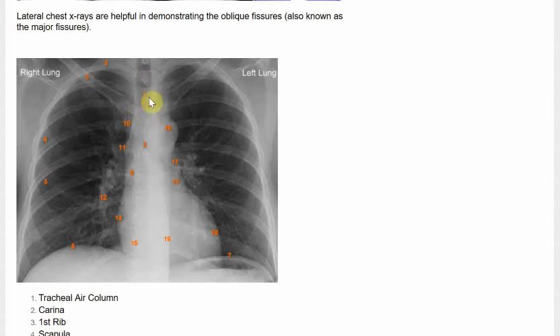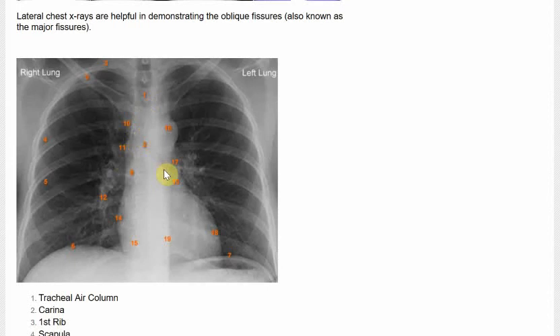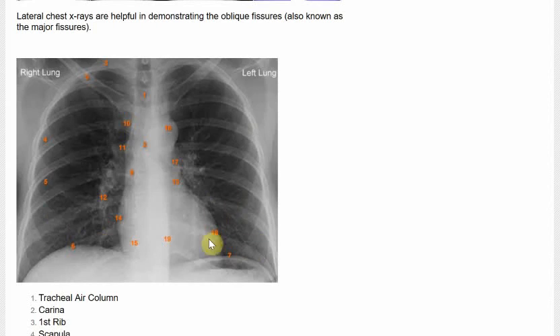Then A for airways — this is my system now. A for airways, making sure the airway is central and there's no pneumothorax where the trachea would be deviated. B is for bone and breast — making sure there's no bony metastases, because I have diagnosed a problem with cancer in someone with breast calcification. The breast sits there as you all know, and check for the presence of bony metastases. So B for bone and breast.